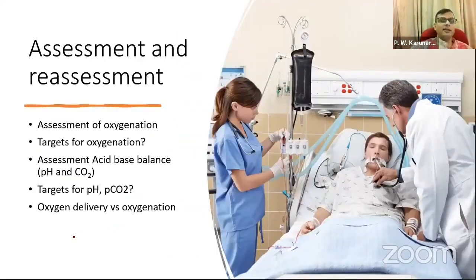The other important thing is assessment. Always try to figure out whether the oxygenation has improved. What is your target of oxygenation? Don't try to over-correct the oxygen. Don't try to achieve 100% in the ward setup, because that requires high pressures and very high PEEP. Try to be happy with 94%, 92%, depending on different scenarios. You may have to be happy with a lower oxygen level, but at the moment, 94 is enough for a ventilated patient. Don't try to make it 100% by giving very high pressures and very large tidal volume.